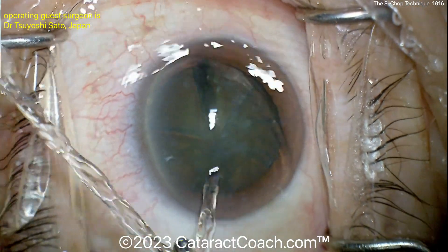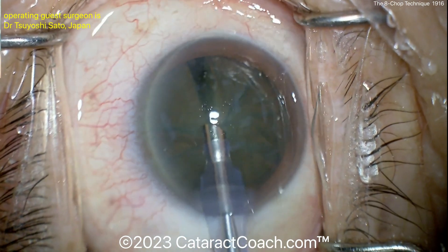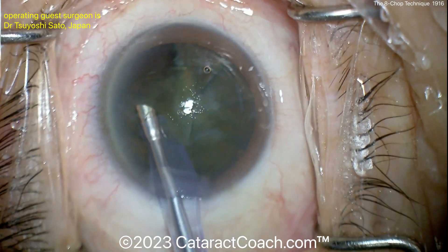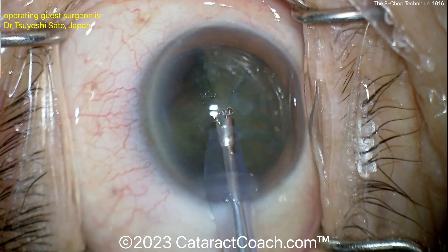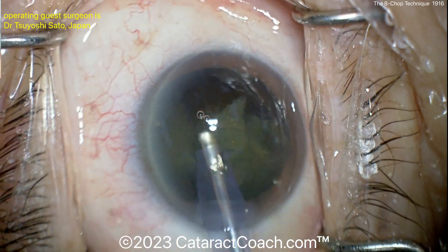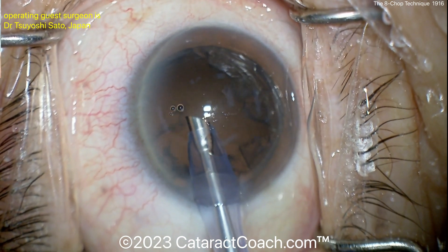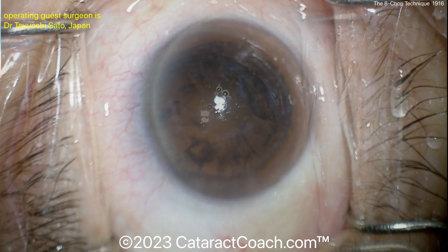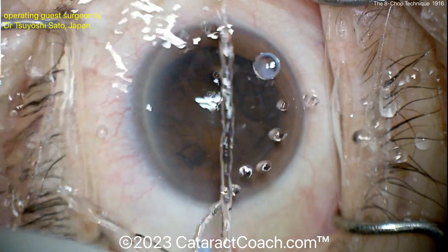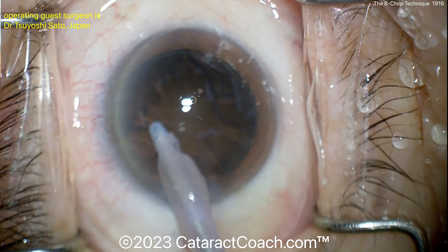Now going in with the phaco probe to take out these smaller pieces — should be relatively straightforward. I've not been a big user of the pre-chopper; I've tried it but prefer a two-handed technique like traditional phaco chop. I started off learning the Nagahara chop technique. But you can see where the pieces are already broken up — it's easy to remove the cataract, it goes out fast. Now going in with the IA probe for irrigation and aspiration.